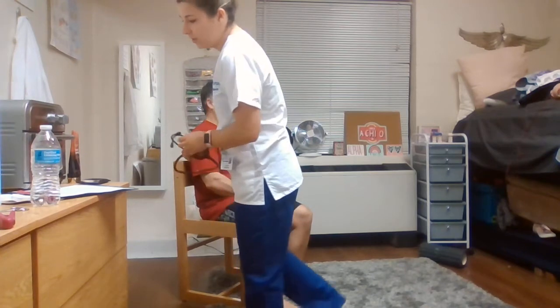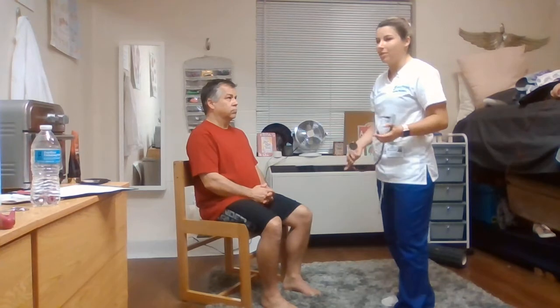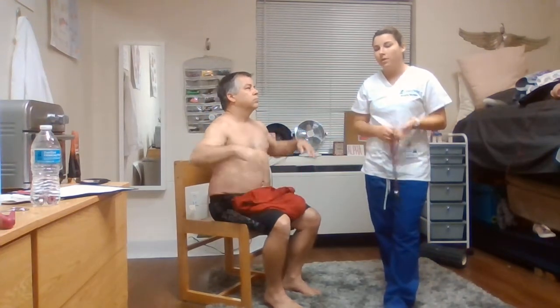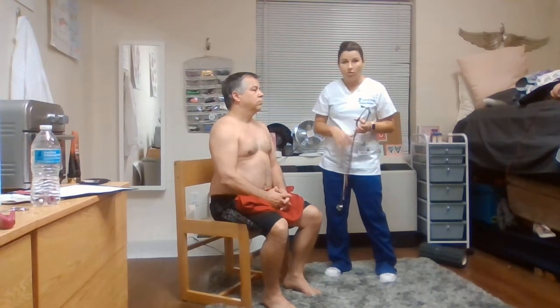I'm going to listen to some heart sounds now. So I'm going to ask the patient to take off their shirt. If we were in a normal hospital setting, I would have a gown that I could open and close as needed, but for this purpose, we're going to have him take off his shirt. All right, so I'm going to start by listening at your second intercostal space at your right sternal border to listen to the aortic valve.